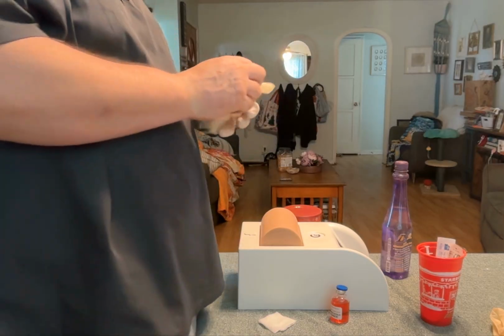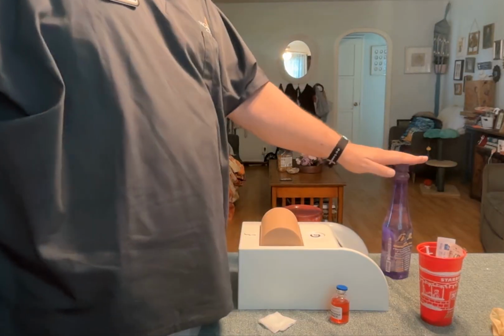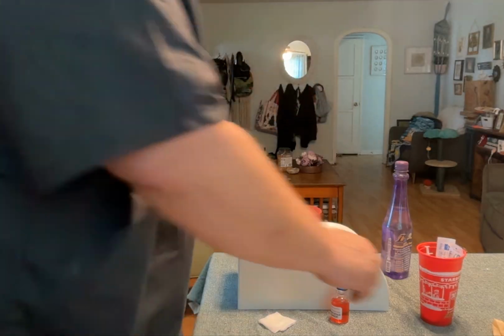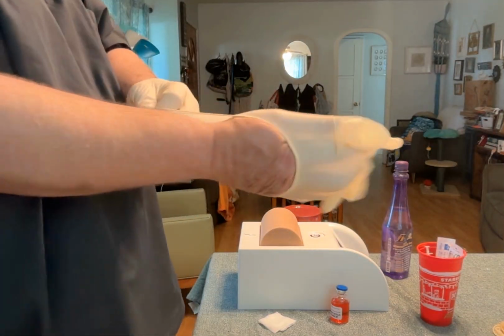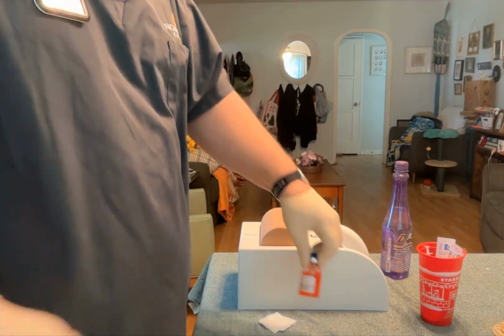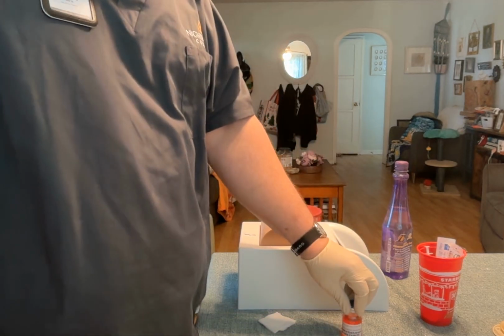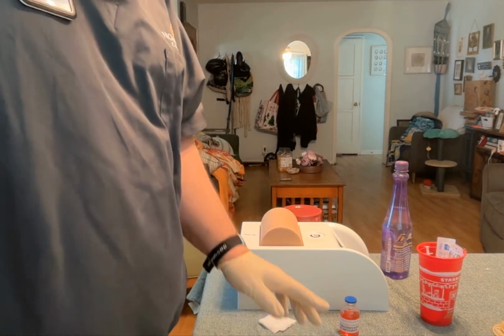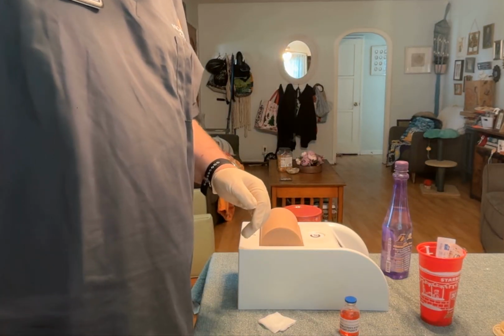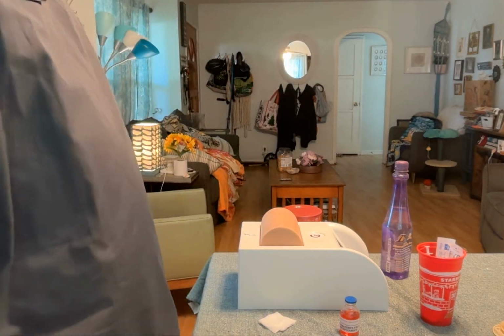So I remove my current clean gloves. Perform hand hygiene. I put on another set of clean gloves, and I get my medications. So I verify my dose is going to be 1.5 milliliters. That's what I'll have in my syringe. I've got the correct syringe. I've got the correct needles.